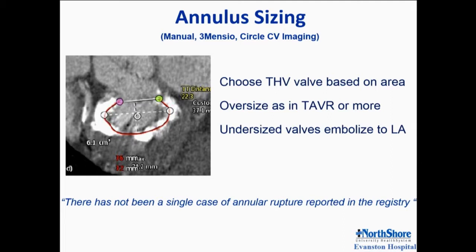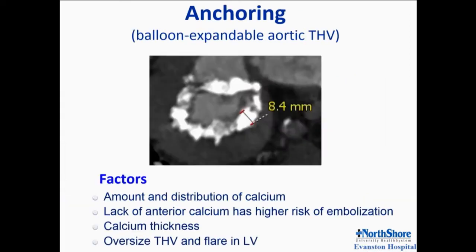So if you are in between two sizes, try to go with the larger one, because undersized valves, we do know that even with proper technique, they do embolize to the left atrium. Anchoring a balloon expandable valve is challenging. There are factors that can contribute, like the amount and the distribution of calcium.